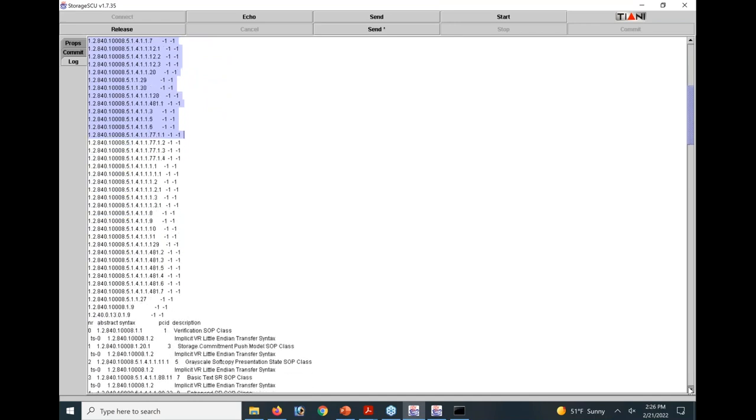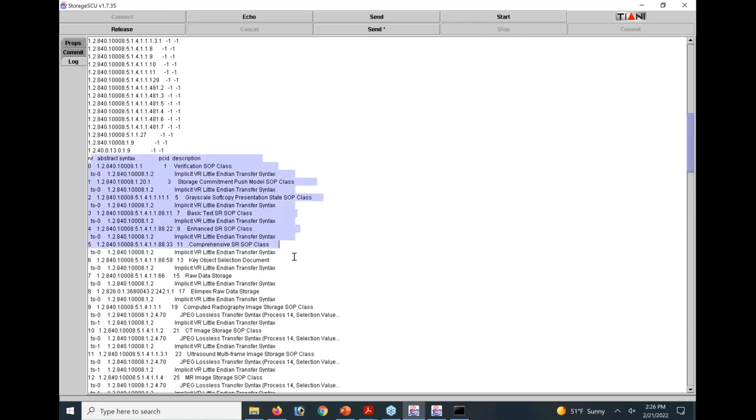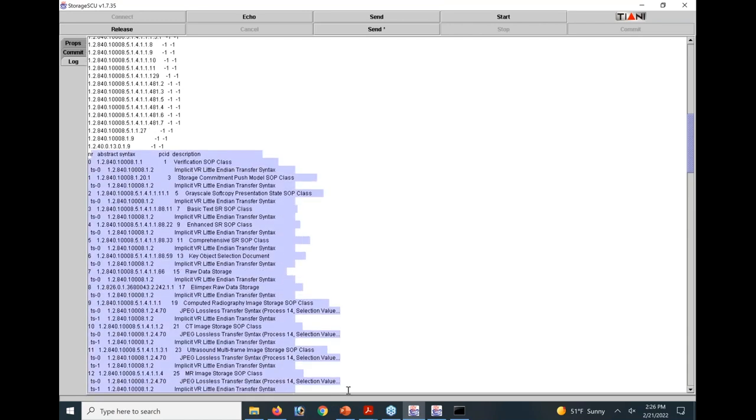So who's talking here? Still the SCU. Again, I know it's hard for you guys to see. One of you mentioned before, little endian, big endian. I think it was you. So here, he's saying, I do enhanced SR, little endian. CR images, JPEG, CT, ultrasound, little endian, big endian, lossless JPEG compression. All of this stuff is negotiated in advance. Has the SCP even responded yet?